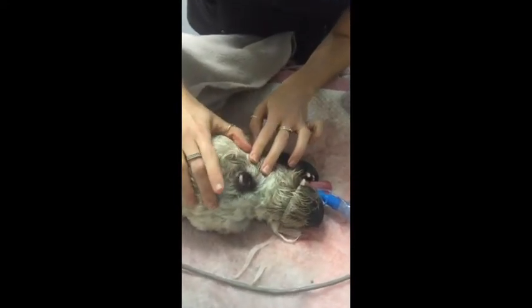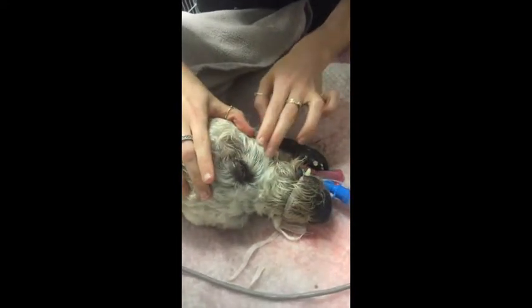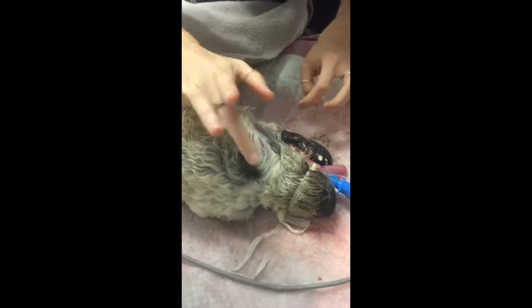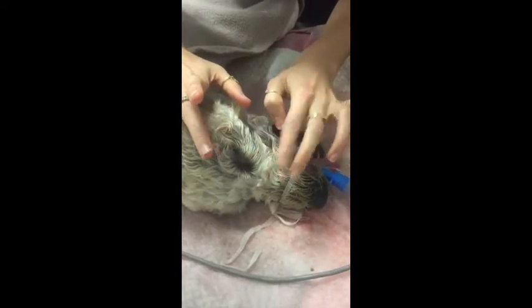Firstly, eye position is checked. This patient's eyes are rotated ventrally, which indicates that they are in a good surgical plane of anaesthesia. We then check for the presence of a palpebral reflex.